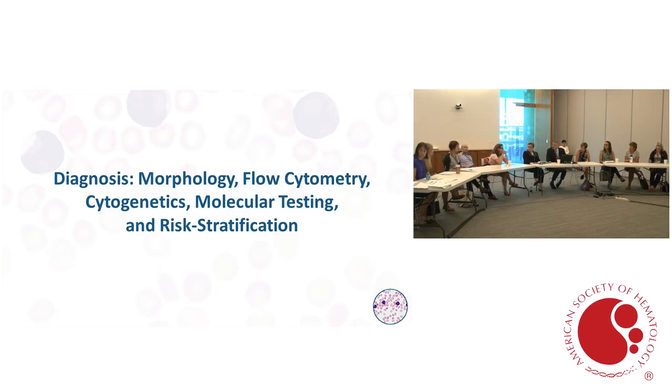We also have available pathologists who do it, and some of it's a training requirement for pathologist fellows and such, and they do several. Okay. So who prepares the smears? The technician comes right there, and she prepares. Yeah. I can't overemphasize the importance of having a high quality sample to diagnose AML. You have to get an accurate blast count to make sure you reach the 20%. So having well prepared smears that are well stained, I think, is very important.